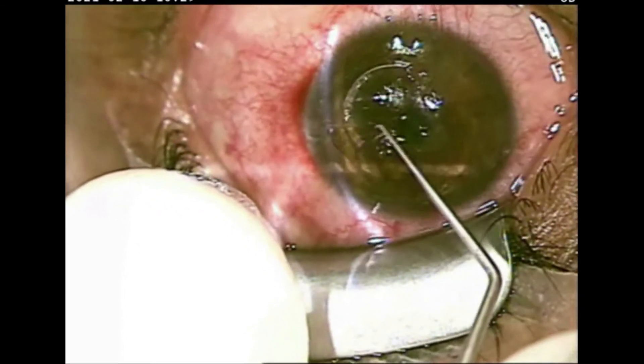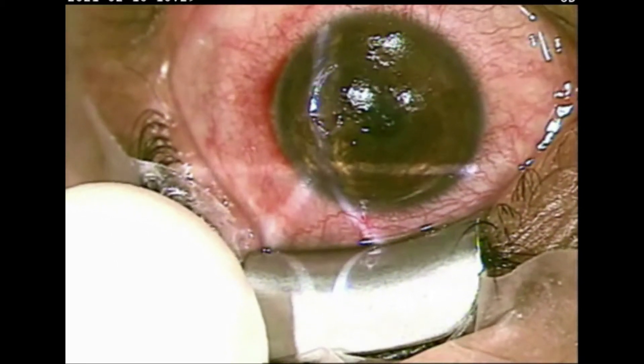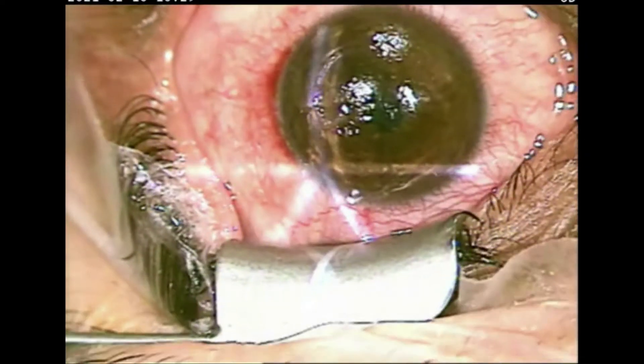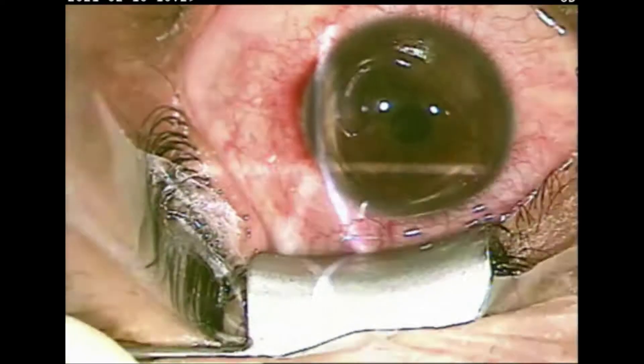In this video, I will use a tunnelizer. I will go under the corneal ring, make a tunnel, and push the ring into the tunnel.